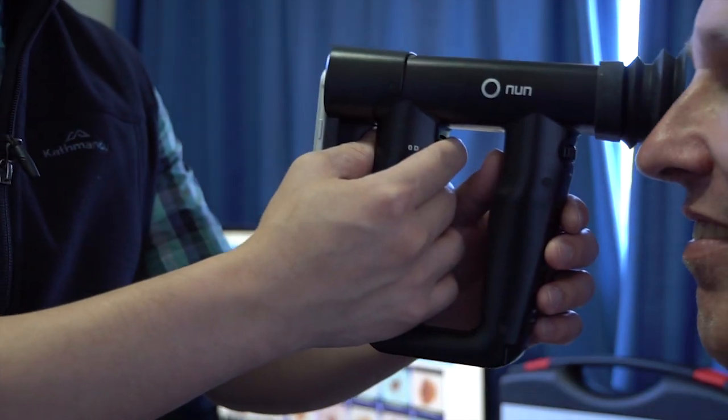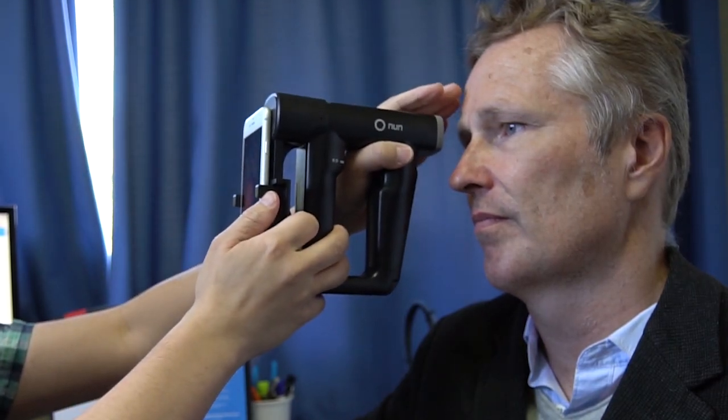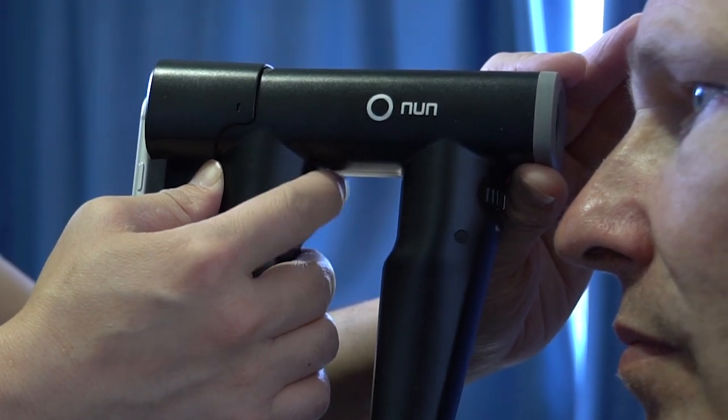For beginners, use the eye-cup as a guide for distance. For experts, you can place your fingers against your patient's forehead as a guide. The closer you are towards the patient's eye, the wider the field of view.